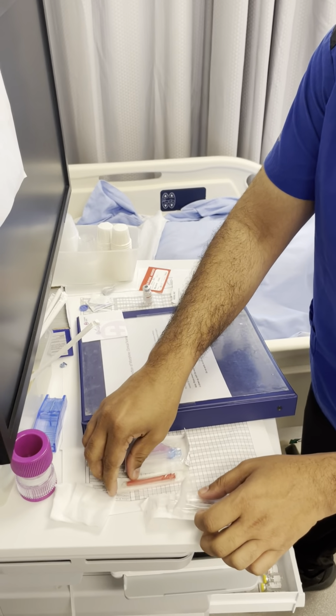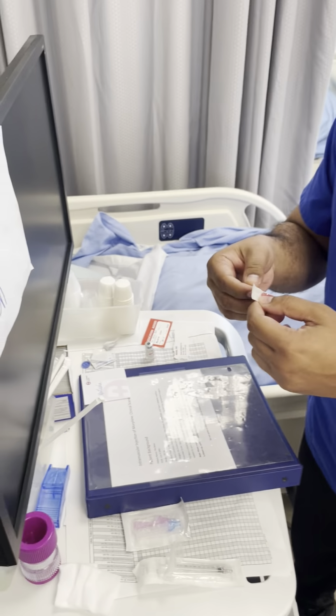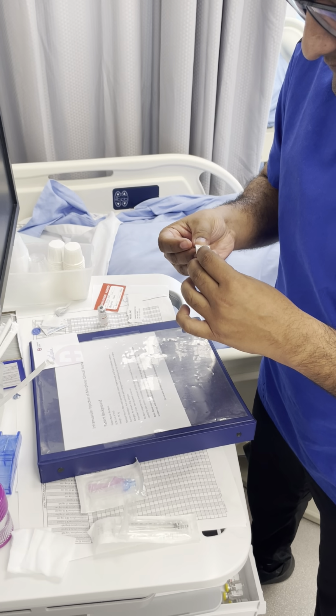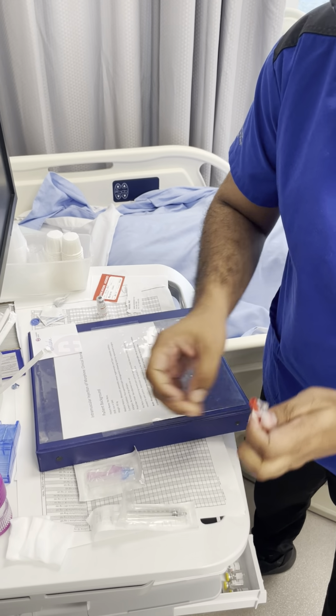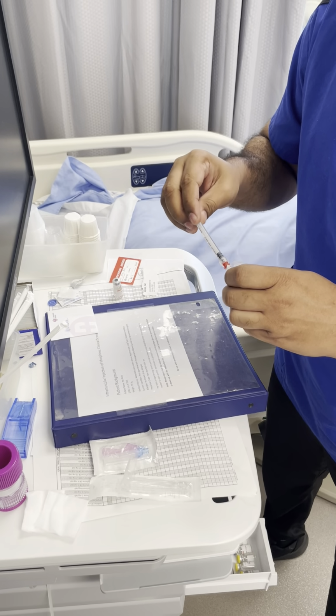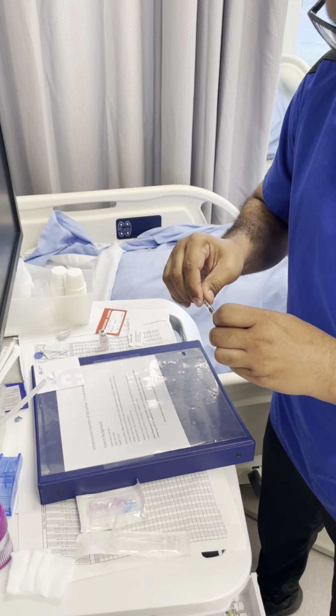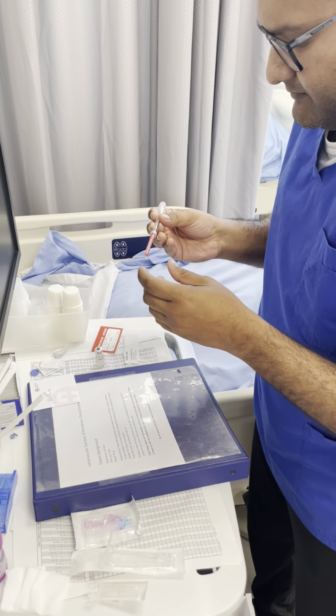I'm now going to prepare my syringe. Perfect.